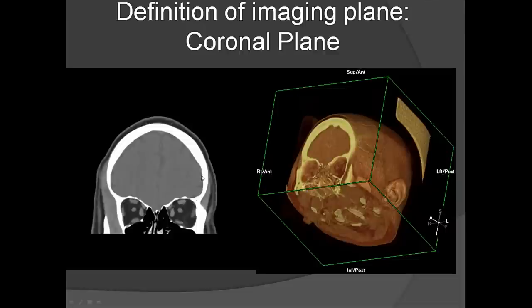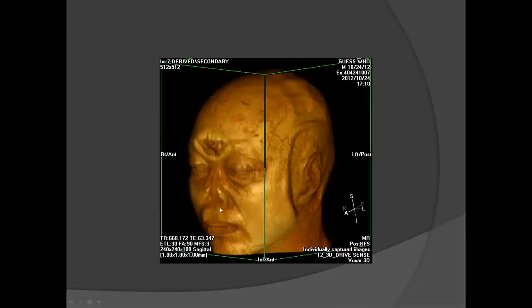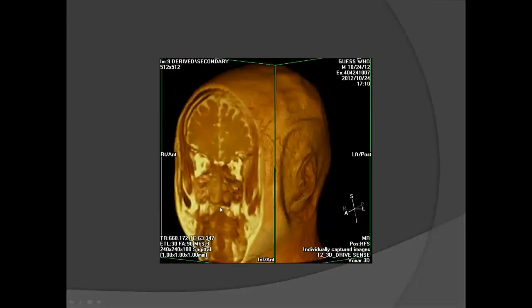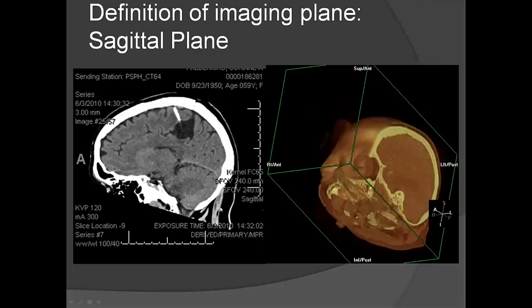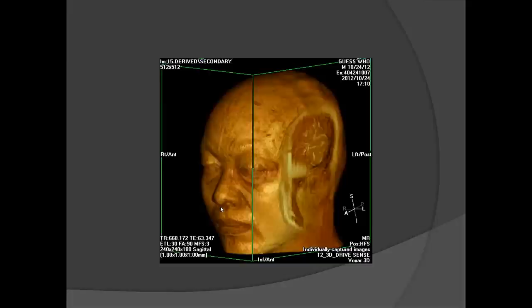In the coronal view, the patient is facing us — again, patient's left side is our right side, cutting through like this. In the sagittal view, we usually scroll from left to right, and I'll tell you where I am as we go.